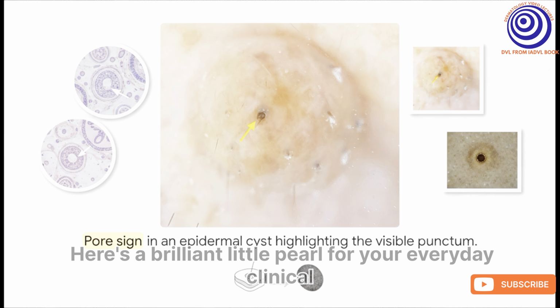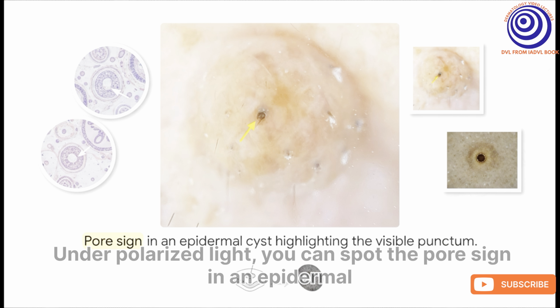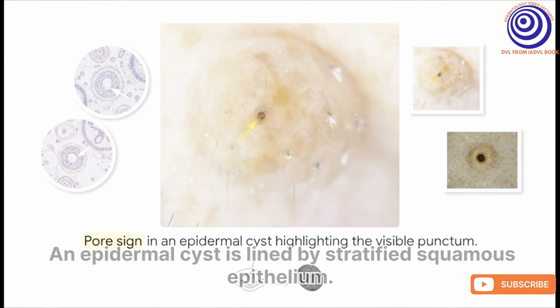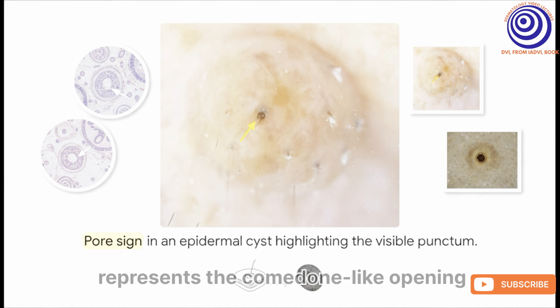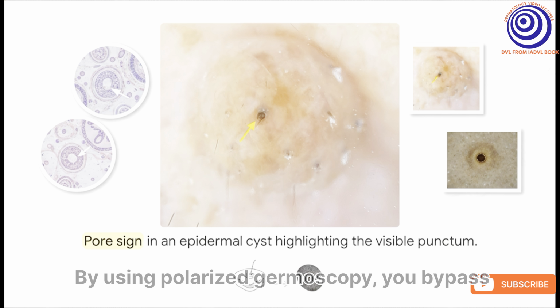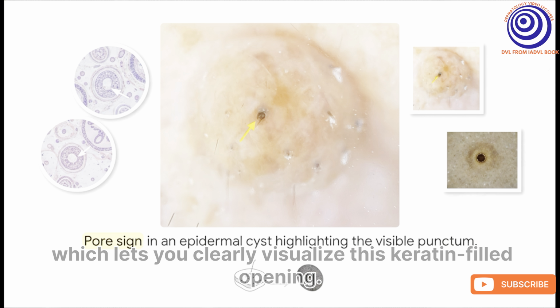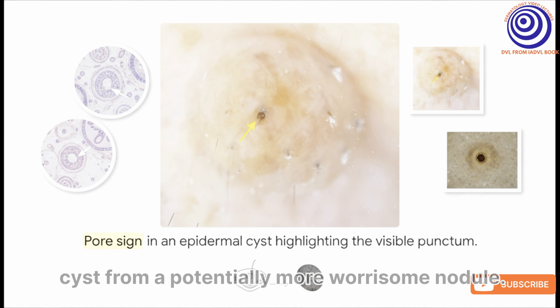Here's a brilliant little pearl for your everyday clinical differentiation. Under polarized light, you can spot the pore sign in an epidermal cyst. Think back to your etiology. An epidermal cyst is lined by stratified squamous epithelium. This central punctum, the pore sign, represents the comedone-like opening of the occluded infundibulum. By using polarized dermoscopy, you bypass that surface light reflection of the skin, which lets you clearly visualize this keratin-filled opening. It's a fantastic way to instantly separate a totally benign cyst from a potentially more worrisome nodule.